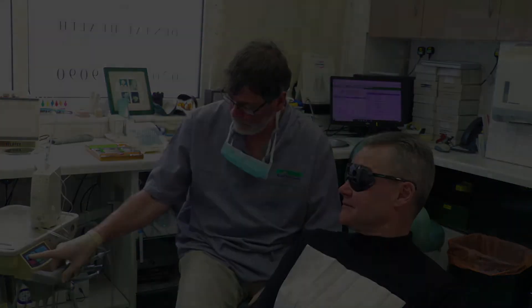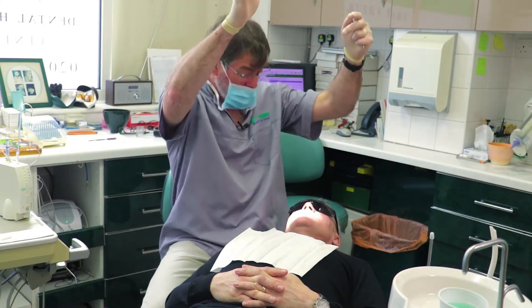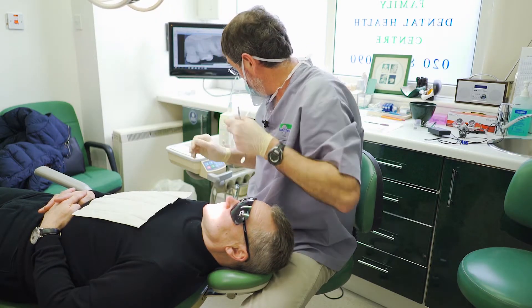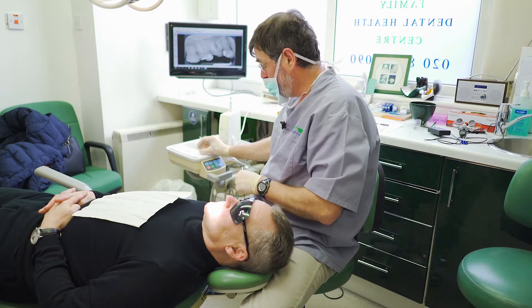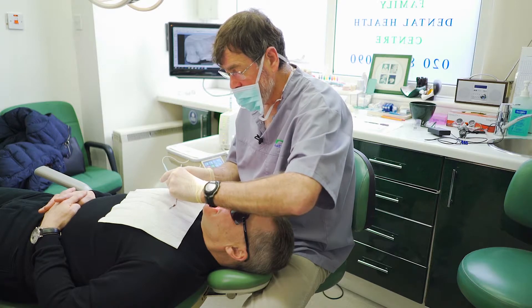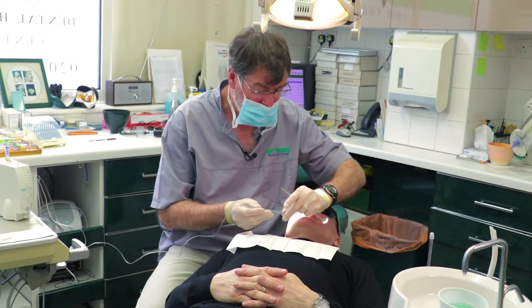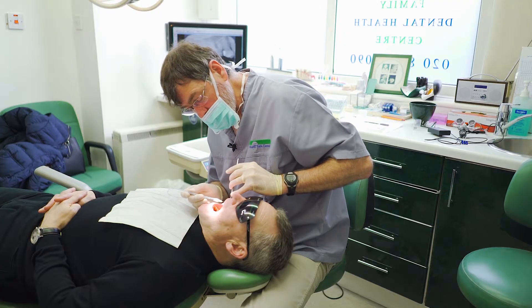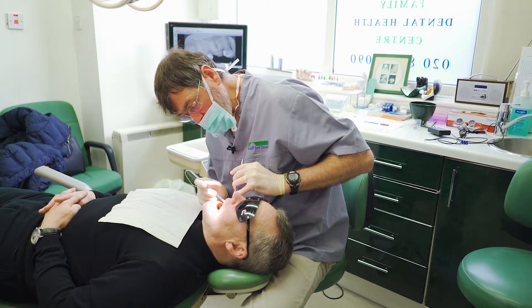Pop the chair back for you now. Are you comfortable? I am, thank you very much. You'll hear a little bit of beeping and bonging going on here — I'm just testing the machine, it's telling me what it's doing. The reason we do that is so I can concentrate on looking at where things are happening. Just close a tiny bit. There we go.